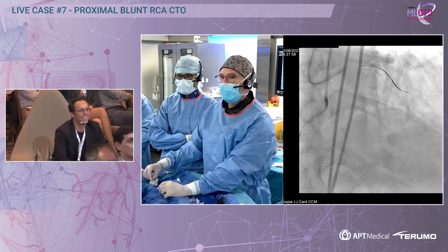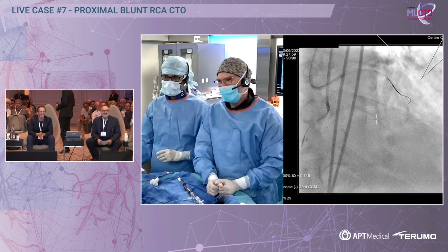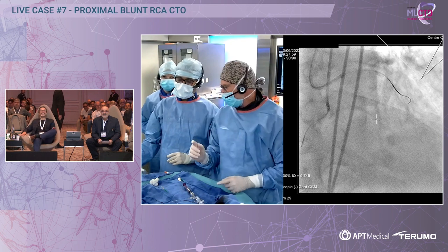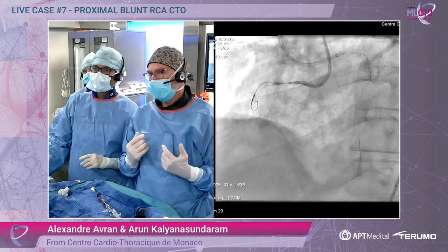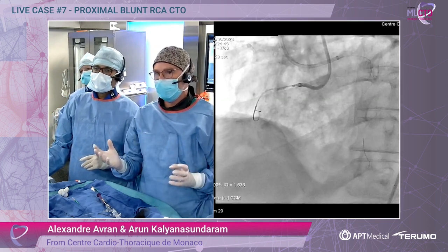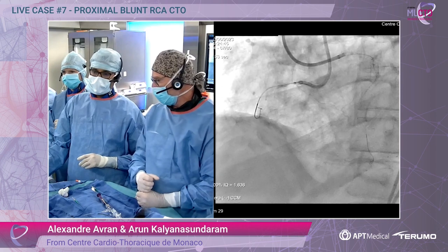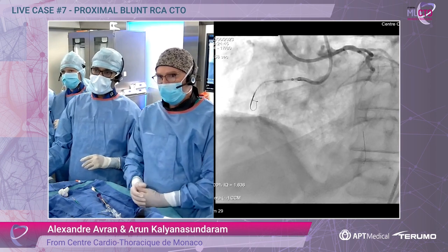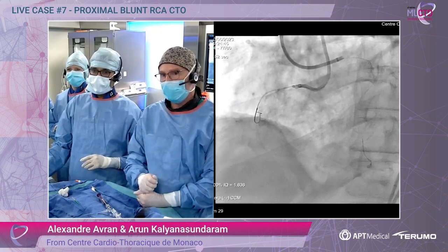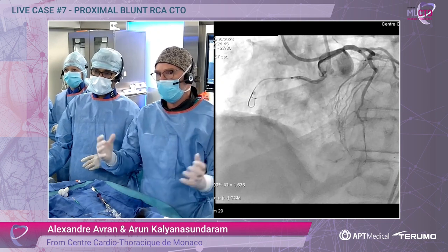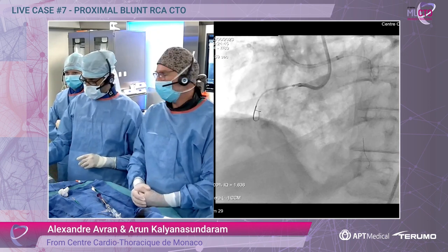I agree with both of you. The point is — and what makes me choose the next strategy — is the size of the knuckle. Because it's a Gladius MG, it's supposed to be a very small knuckle. And here, if I push this knuckle more distally, the space will be too large to use Stingray straight after. There is also disease in this part and I don't want to lose visualization of the distal cap.